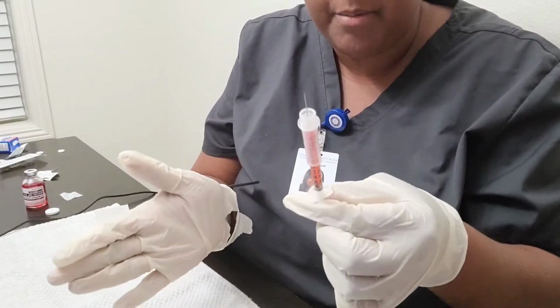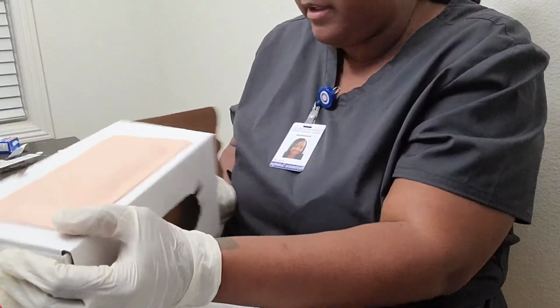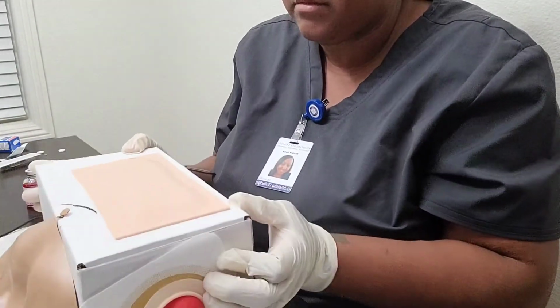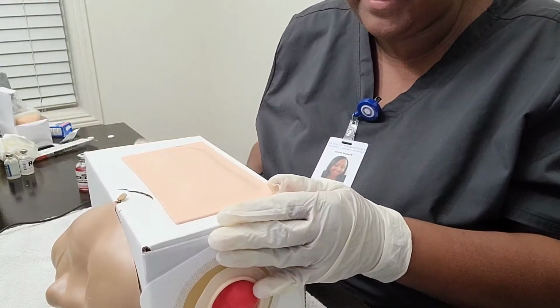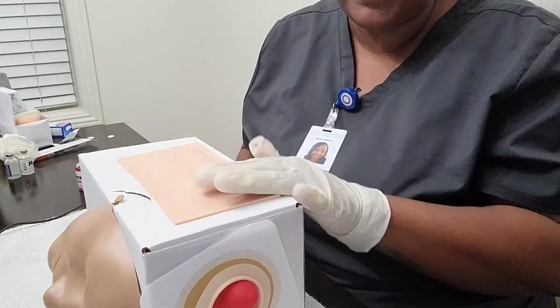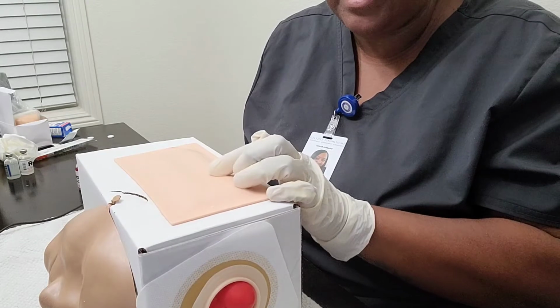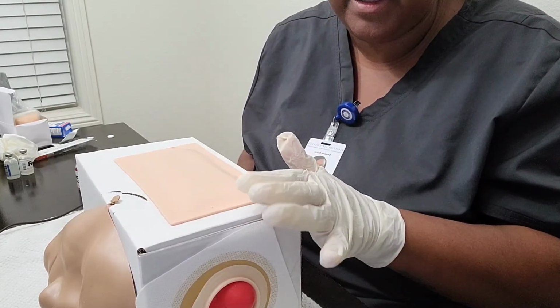Okay, so now I will place this aside, and now I will pick the area for administration. I will inspect the surface, select the appropriate site. I will inspect the skin surface, look for any bruising, inflammation, or edema.